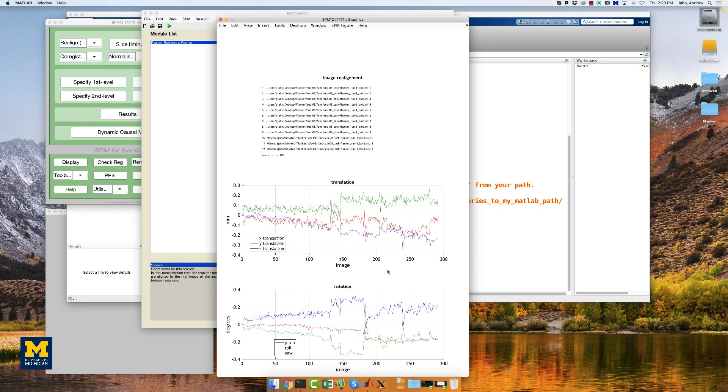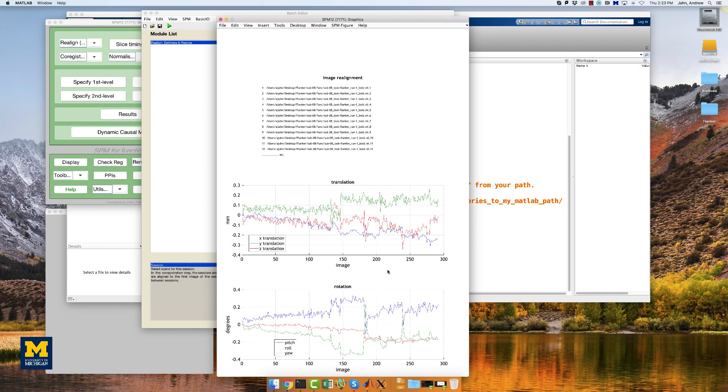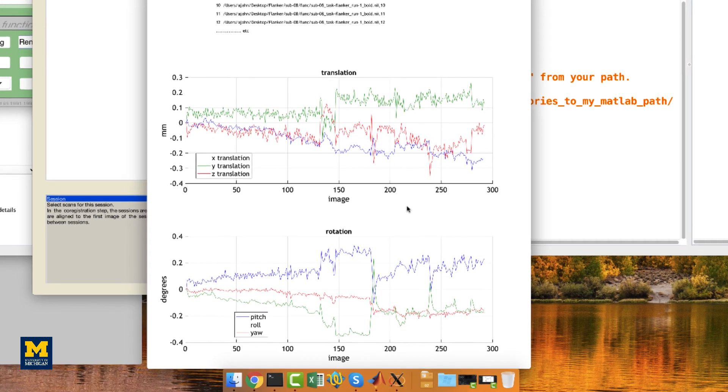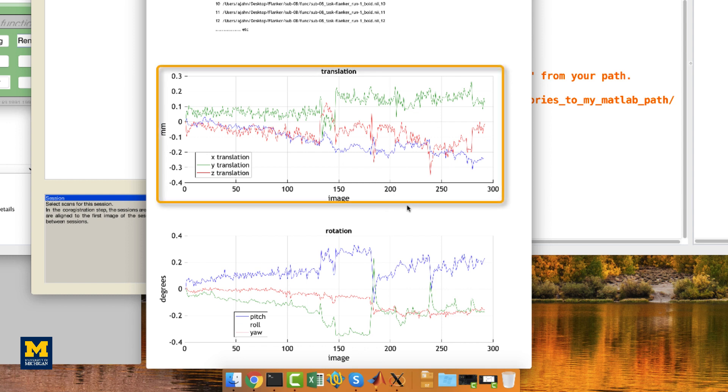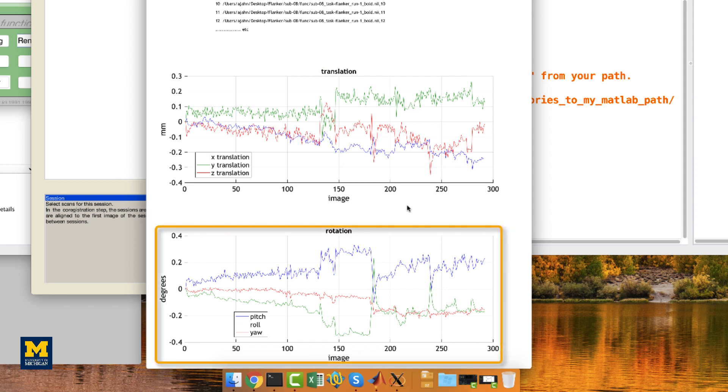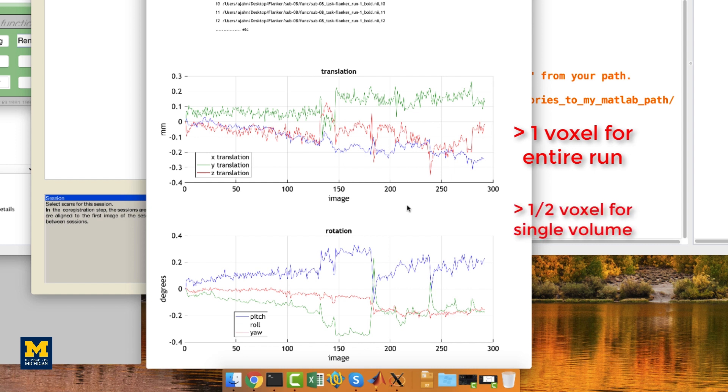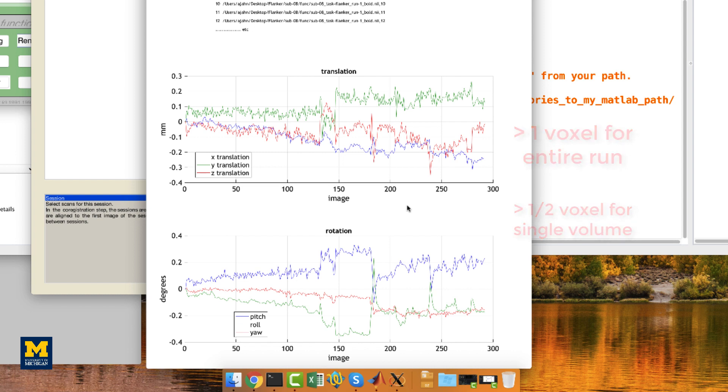When the Realignment preprocessing has finished, it will generate a motion graph showing how much the subject moved in the X, Y, and Z dimensions. Translations are how much the subject moved along each axis, while rotations show how much they rotated around each axis. A rough guideline is to remove any runs in which the subject moved more than the size of a voxel. In this study, more than three millimeters. Or if there is a sudden spike more than half a voxel size. Again, in this study, that would be 1.5 millimeters. In this study, the subject moved very little, as you can see by the y-axis, and so we will include all of their data.